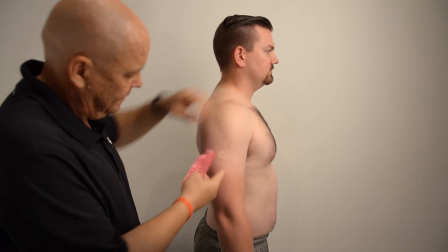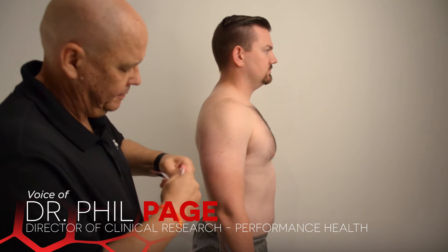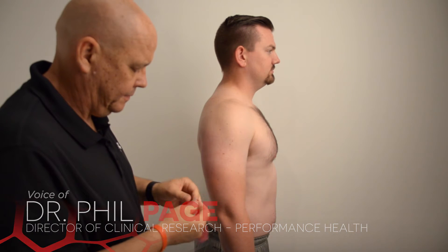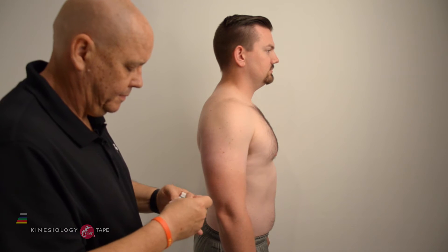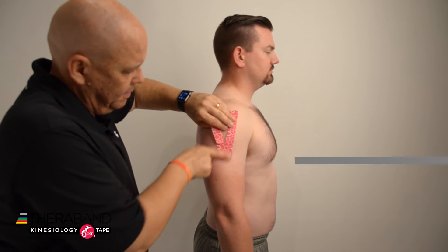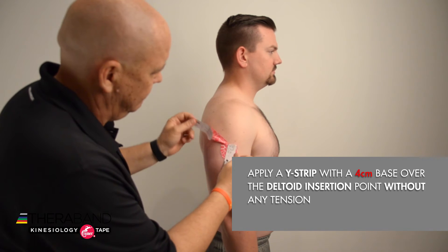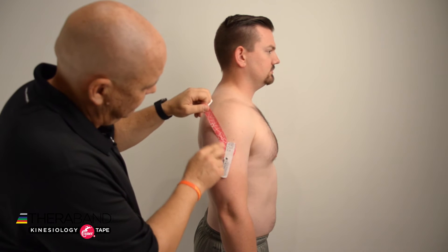I'll begin by identifying the deltoid outline. I'm going to take the Y strip and break the backing at the base about four centimeters below the Y tails. I'll apply that base right over where the deltoid inserts without any tension, then remove the paper backing on the Y strips until about two to four centimeters.